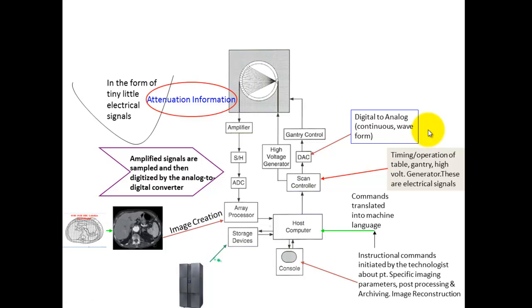And this may look a little bit complicated, but this is pretty much all of what happens. Here's your tube. Here's your x-rays. Your patient would be over here. And these little rectangles represent your detectors. So very quickly, and the promising part here is that this is a video and you can listen to this over and over. Your voltages come out, as we mentioned before.